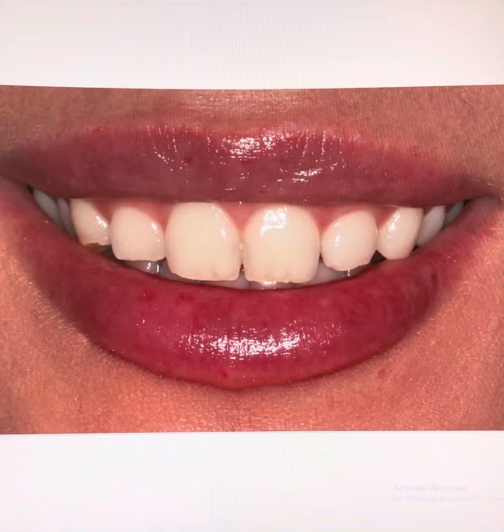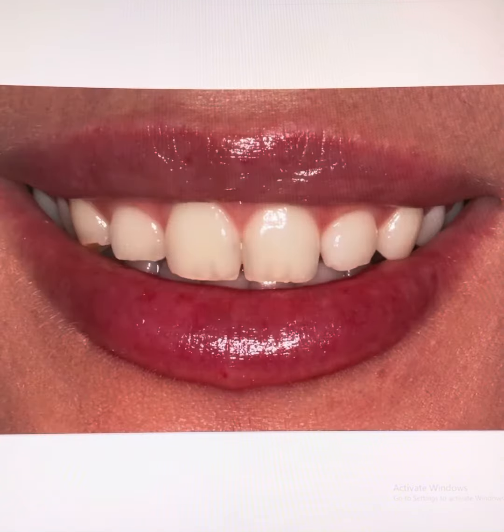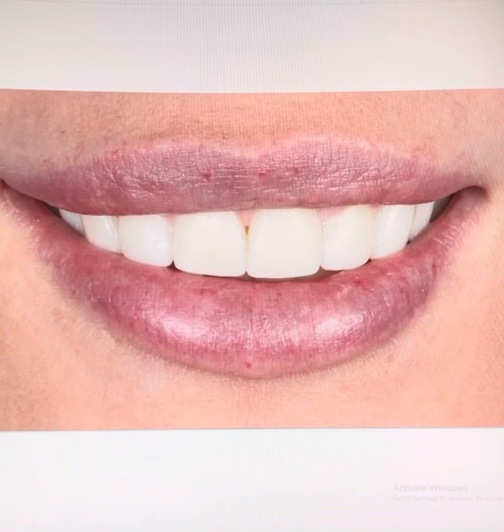We do a small try-in with temporary composite material, showing a natural style with Bleach White 3 color. Patient is happy with the Smile Design, so I can prepare the teeth.